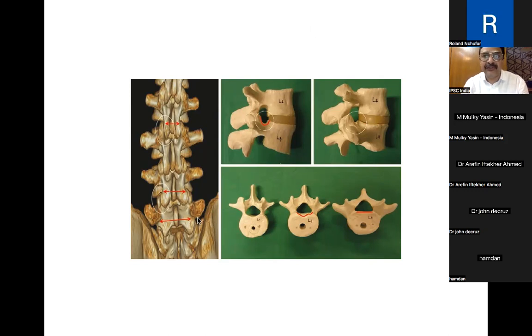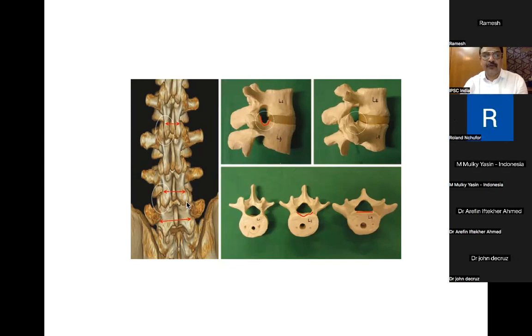Once again, I'll repeat what we discussed in the anatomy lecture. Don't go by the centimeters, don't go by the degrees. Don't make it a fixed idea. A lot of times some people teach that L5 S1 go 12 centimeters, L4 5 go 8 to 10 centimeters, L3 4 go at 8 centimeters. This is not applicable. It all depends on multiple factors which we have to take into consideration.